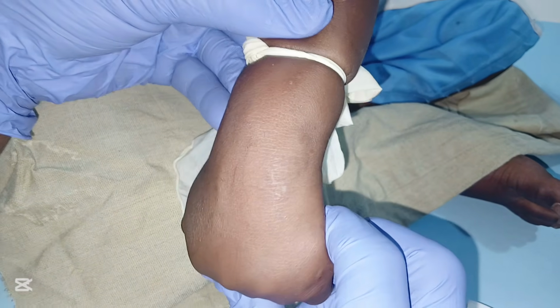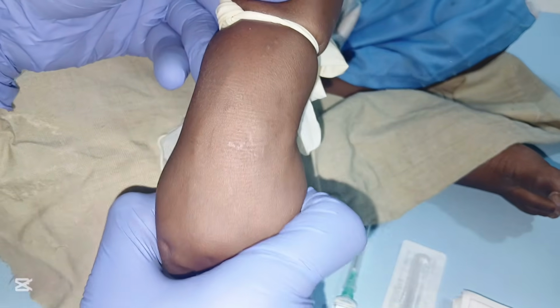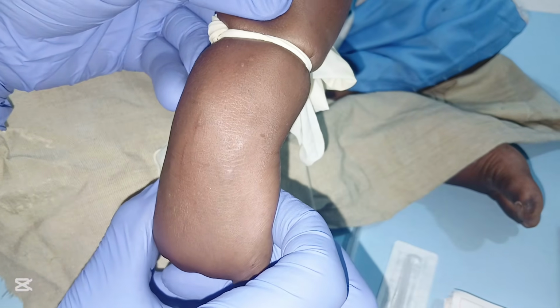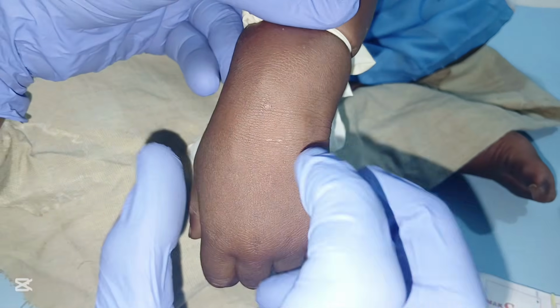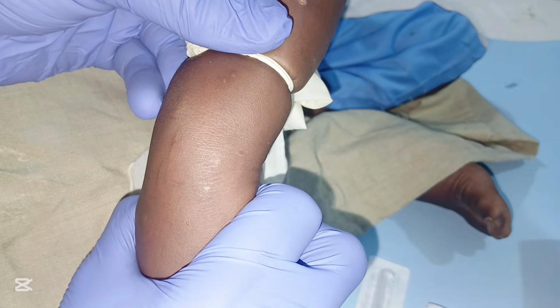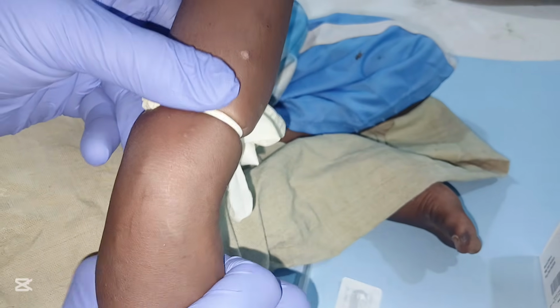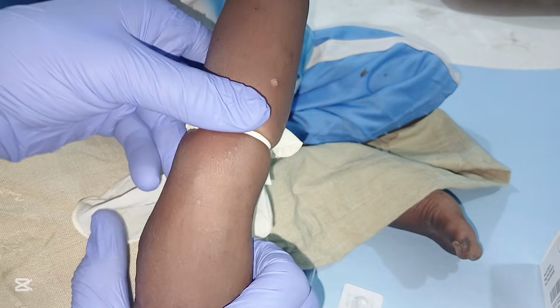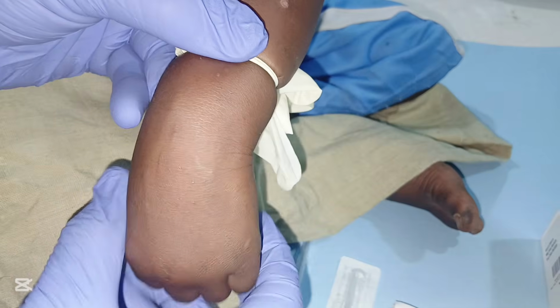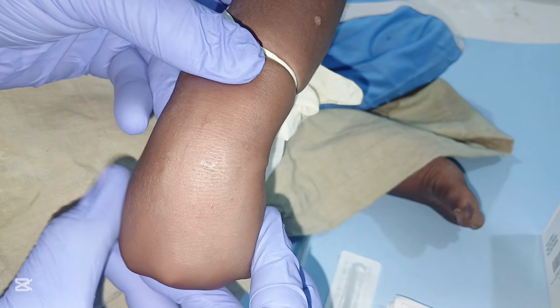So this is the common reason why you're always failing to perform pediatric IV cannulation. If you don't retract back the skin, the vein will not be very visible for you to insert the IV, and you will miss the direction of the vein. When you insert the cannula into the vein, you may miss the right direction to follow straightly. So the common reason why you're always failing to perform IV insertion technique is not retracting the skin back well for the vein to be visible and intact for easier placement of the IV insertion.